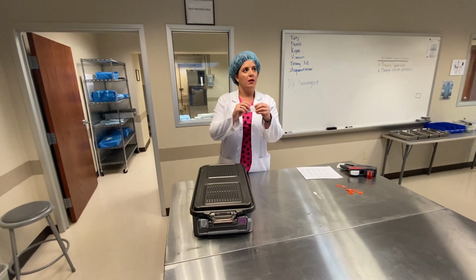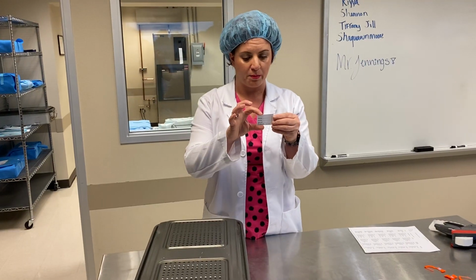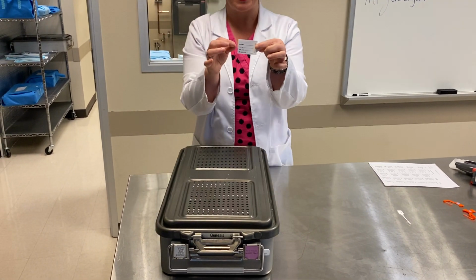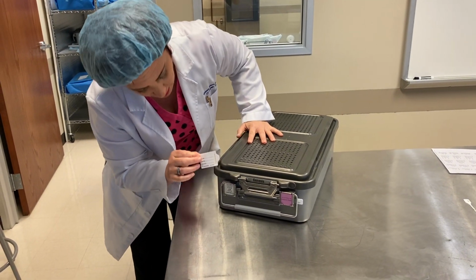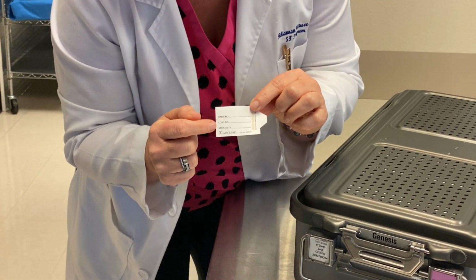Most sterile processing departments have some sort of little card that actually slips into one of these slots. This one doesn't fit into here, but essentially information would be written on here. It says sterilization number, load number, and sterilization date.